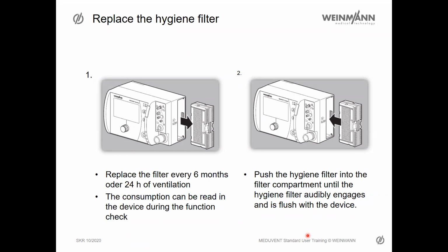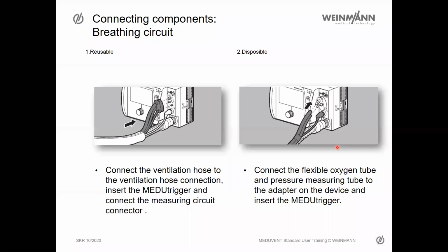When you want to change this hygiene filter, you put these both things together, put it out of the device, take a new one, press it in the device, and you have to hear a click sound that the filter is mounted right in the device.